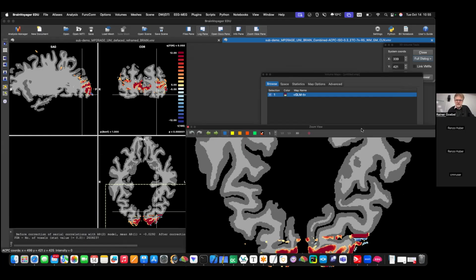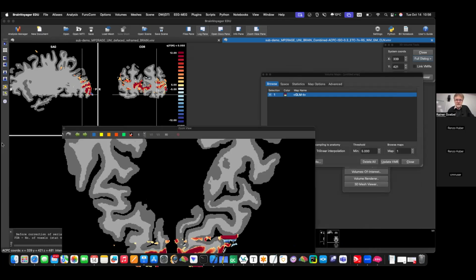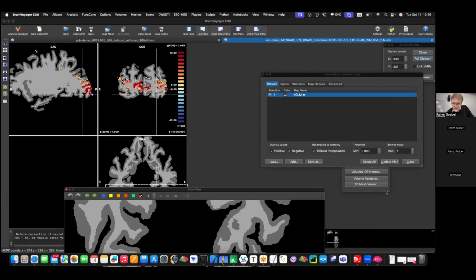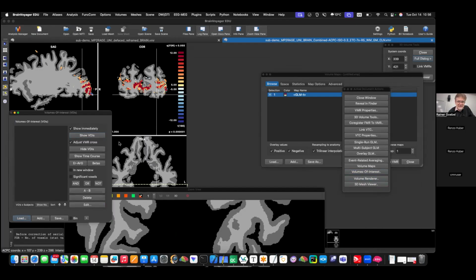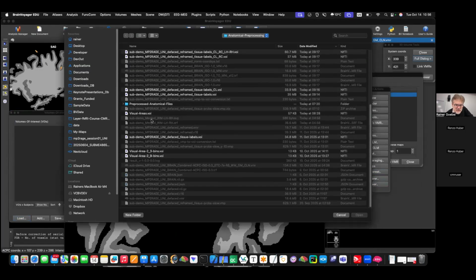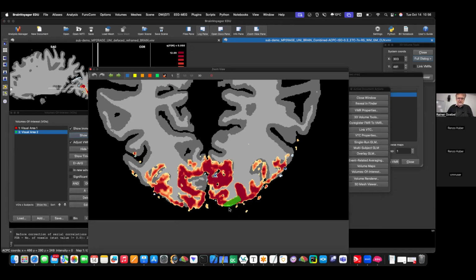And what I do now, show this a bit. You open the volumes of interest dialog, and then you load the prepared file, which are exactly the 2 ones I showed for VASO yesterday. So you open the file, which is called visualareas.voy. This file you should have in your downloads. And if you load this, you actually see them here, green and red.